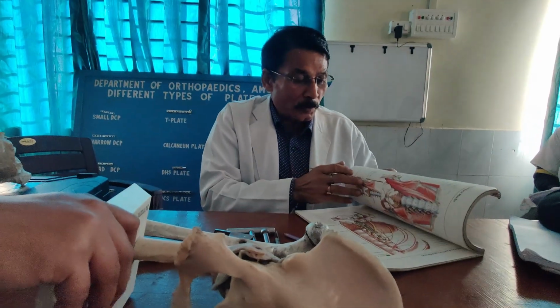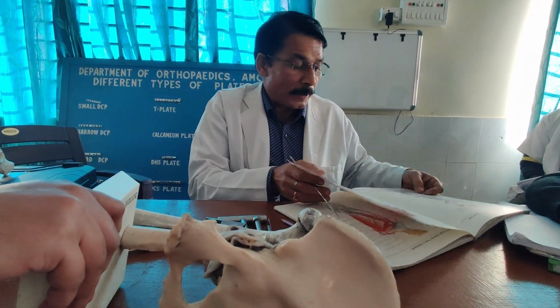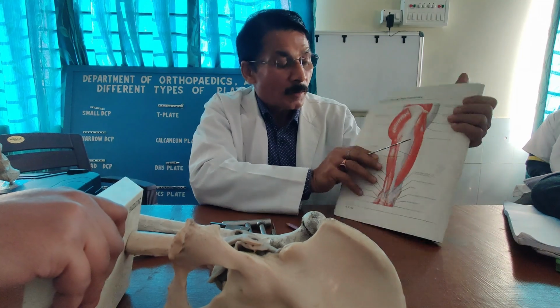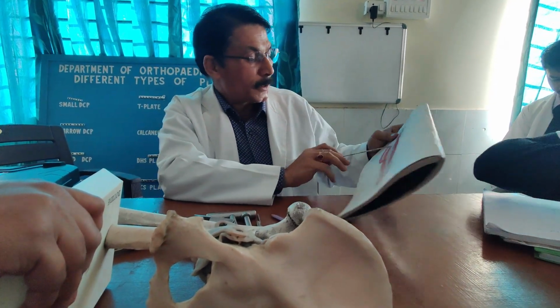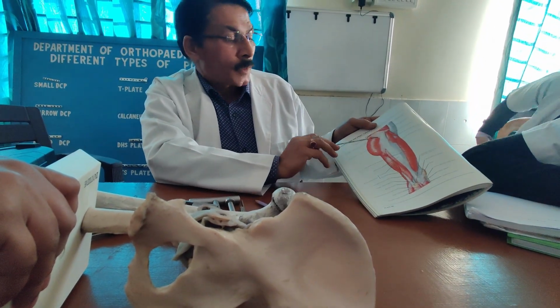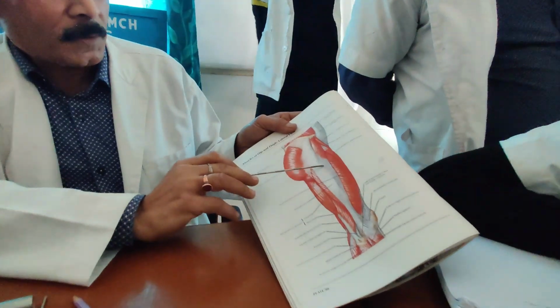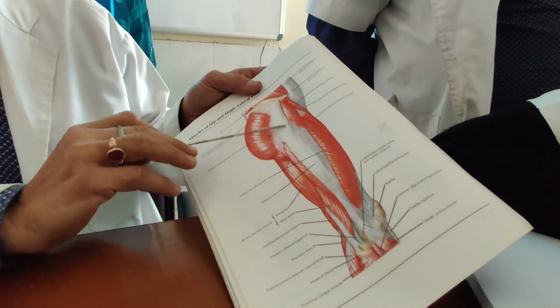Now what next is coming to you, in front of you? Vastus lateralis. Yes, that's right. What can you do with the vastus lateralis? There can be two things. We can split it or we can go through. This is the picture. The patient is there. This is the tensor fascia lata, so your tube is somewhere here. This is your base. This part will be cut.